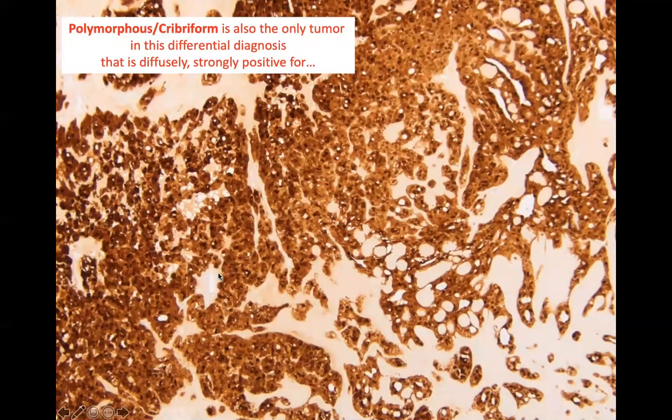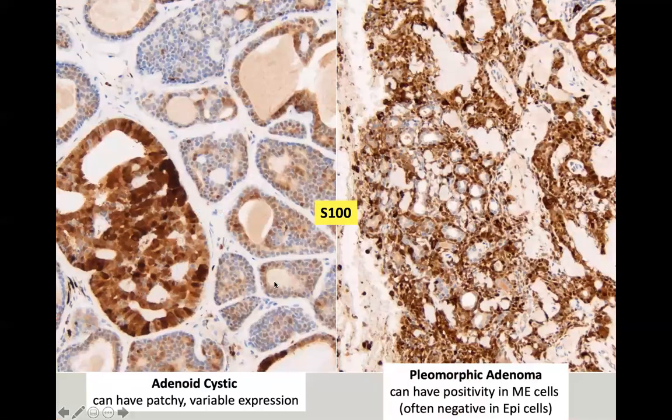Okay. The other immunostain that's very helpful in this differential is S100. Polymorphous is the only tumor that is diffusely strongly positive for S100. We saw how the immunoprofile of S100 in our chart can be quite variable. This is one of those cases that is diffuse and strongly positive. In adenoid cystic, as well as in PA, it can be somewhat patchy, and it doesn't have quite as clean a geographic distribution as we might expect. Like, it's not obviously staining the myoepithelial cells or the epithelial cells. It's just kind of a little bit dirty.